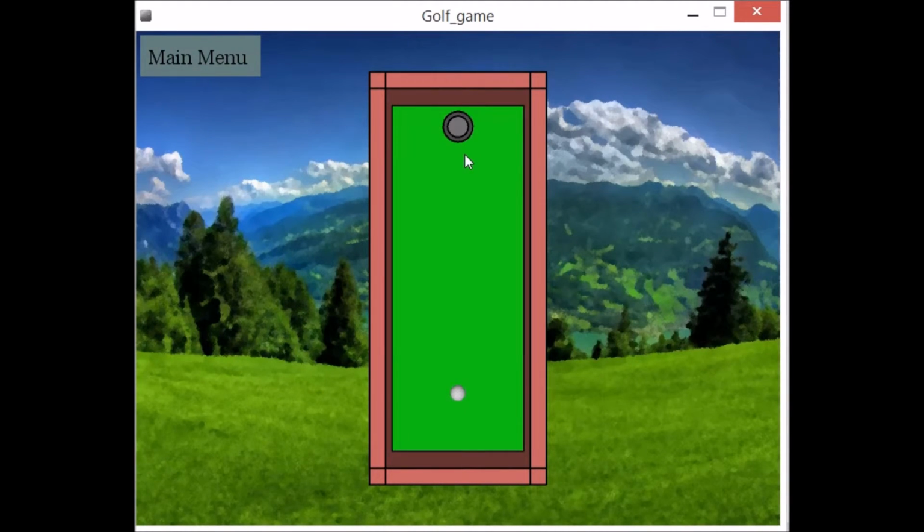Here you can see the basic golf course that we have right now. Something we'd like to improve in the future would be to add a couple more golf courses in to keep it fun and exciting. But this will prove our concept.